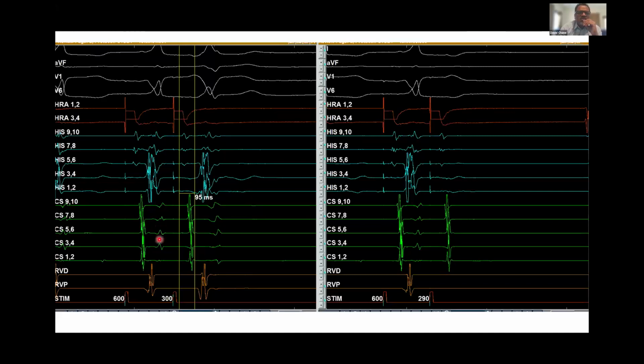which is in the AV groove, we may be able to show ventricular activation happening towards the lateral part of the atrium, lateral part of the mitral annulus, if the catheter has been positioned properly. Anand was talking about premature beats. We try to create artificially premature beats.